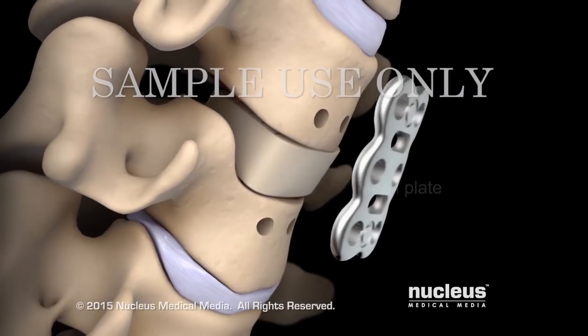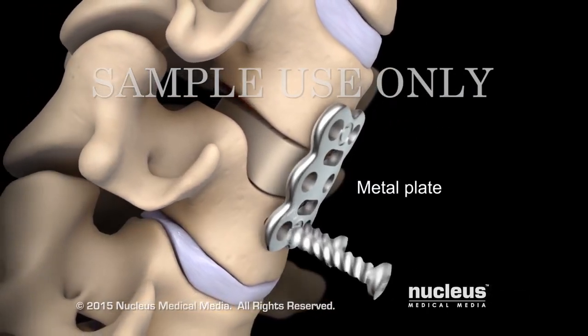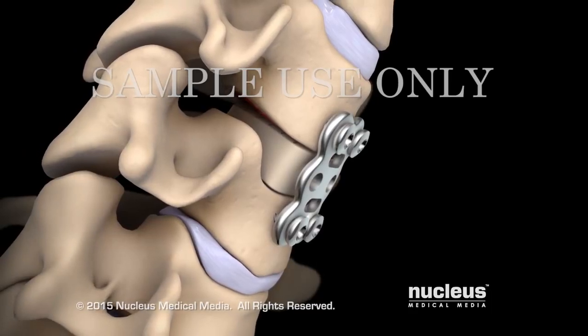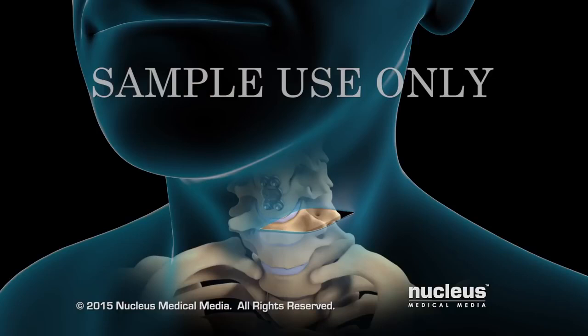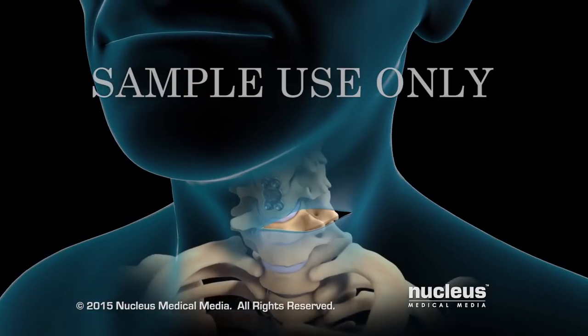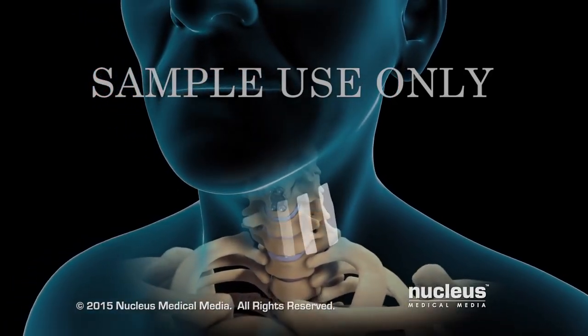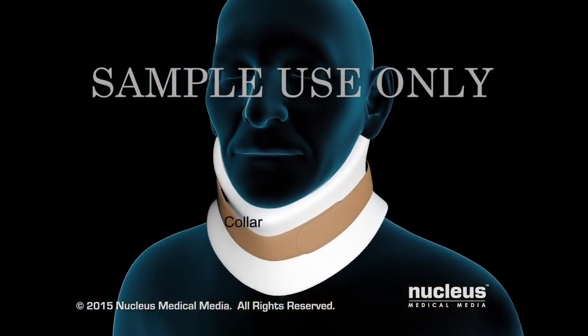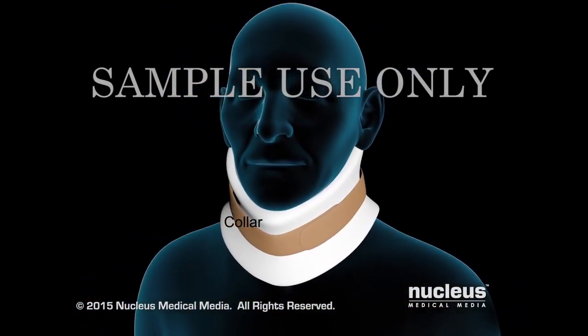Your surgeon may attach a metal plate with screws to keep your spine stable, while your bone graft assists in fusing the vertebrae together. Your skin incision will be closed with skin glue or skin closure tape. Your neck may be placed in a collar to keep it still while your vertebrae fuse.